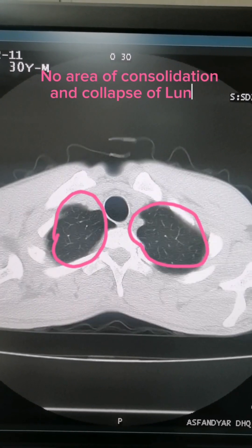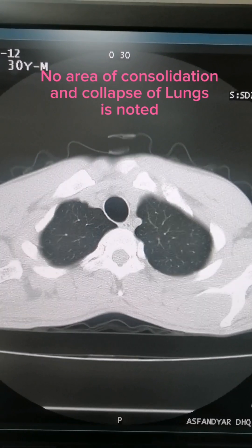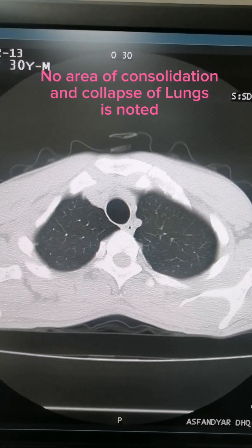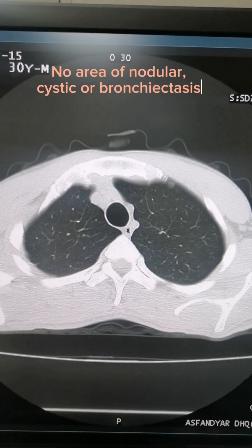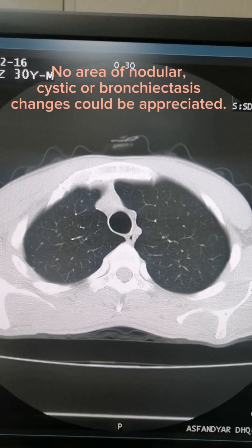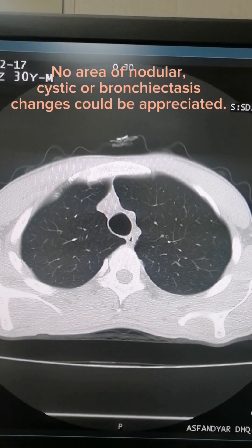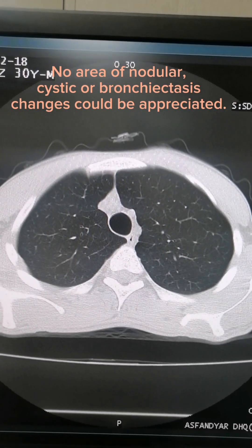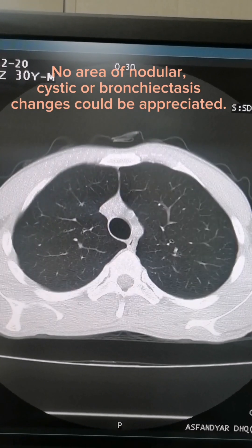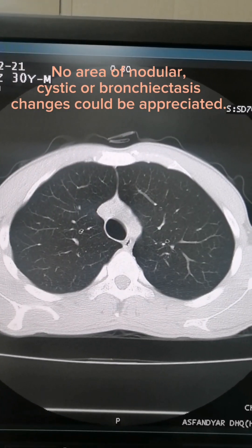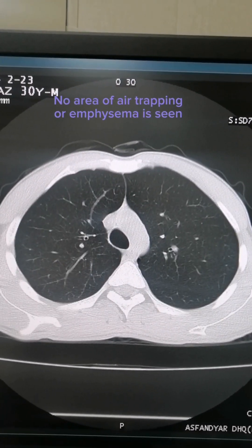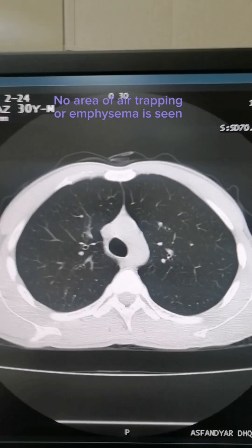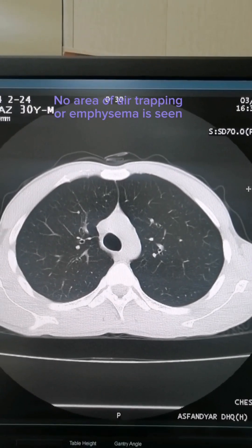No area of consolidation and collapse of lungs is noted. No area of nodular, cystic, or bronchiectasis changes could be appreciated. No area of air trapping or emphysema is seen.